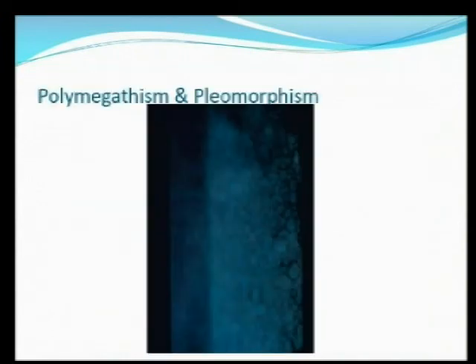And here again is an example of an endothelium that has issues. In this case, a wide range of sizes and shapes to those endothelial cells.